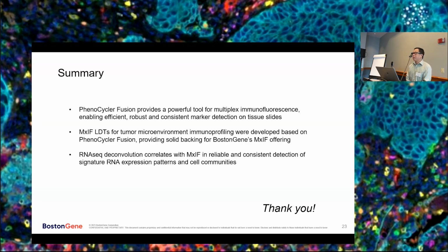All these markers are selected by our pathologist, and we could include more, but this is enough. Commonly, I know in some studies they said even 6 or maybe 10 markers is more than enough. At this stage we just want a more complex, more detailed analysis. That's why I went for that. Our panel averages 25 to 30 markers. We think that's the best we can handle.